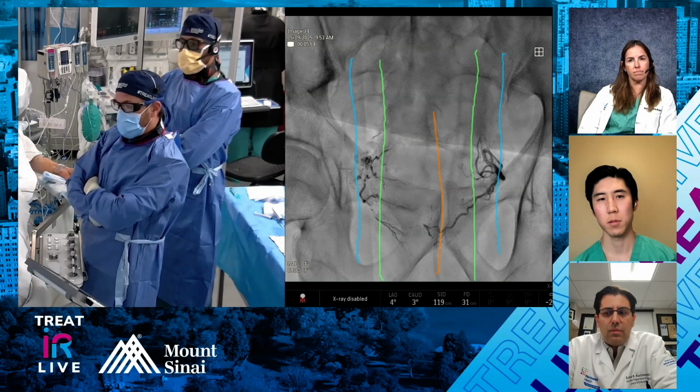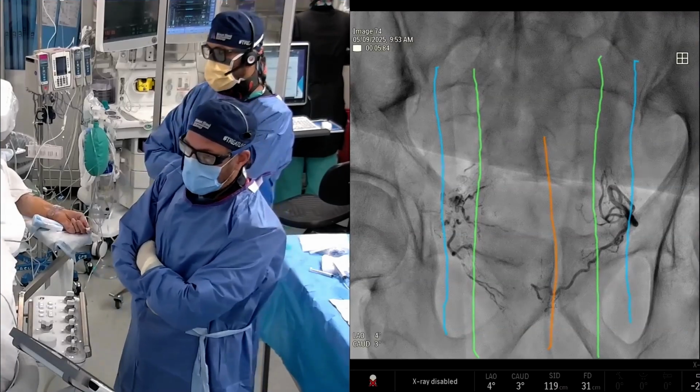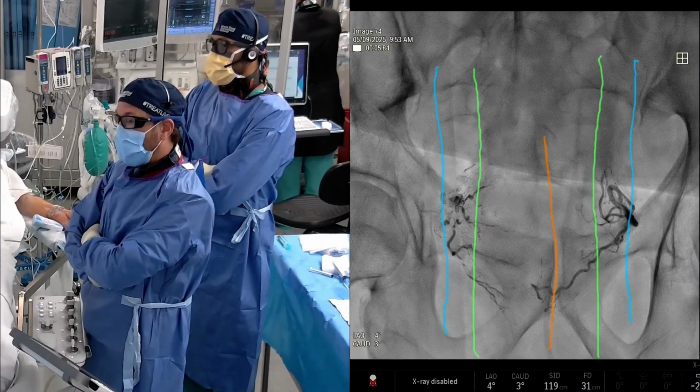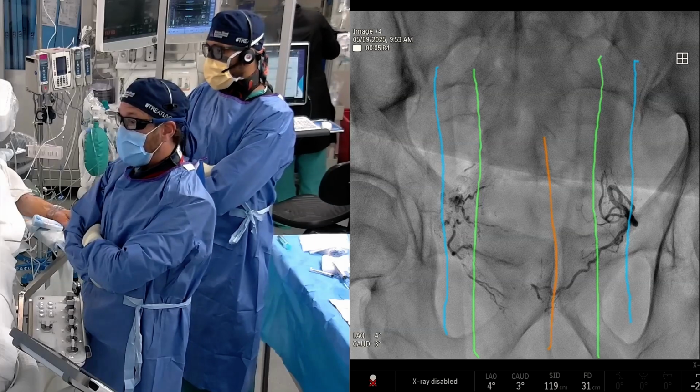And based on the literature, we've seen many studies on this. 80% of patients can have the catheter out by 4 to 6 weeks. And that's been our clinical experience as well. I'm sure you guys probably see that in your practices as well.